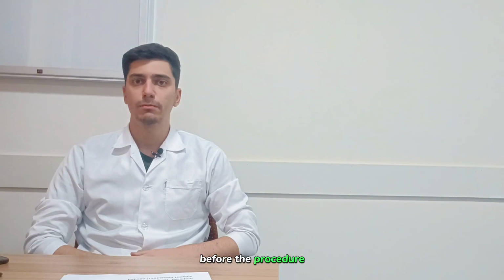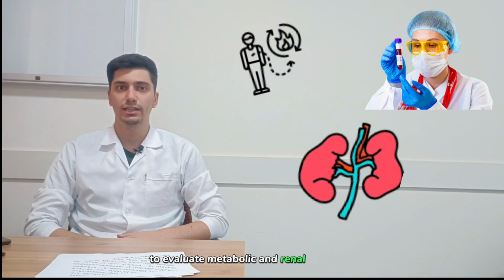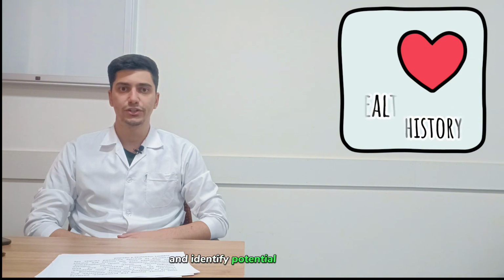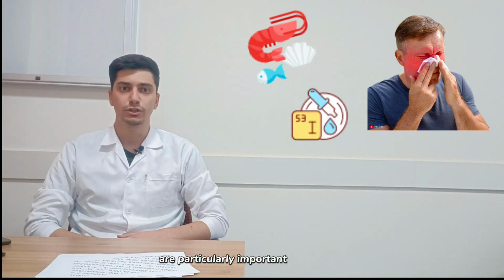Now, let's talk about what happens before the procedure. Patients undergo various blood tests to evaluate metabolic and renal functions, as well as coagulation studies to anticipate the risk of bleeding. We also assess the patient's health history to determine any previous reactions to contrast agents and identify potential risk factors. Allergies to seafood or iodine compounds are particularly important to consider.